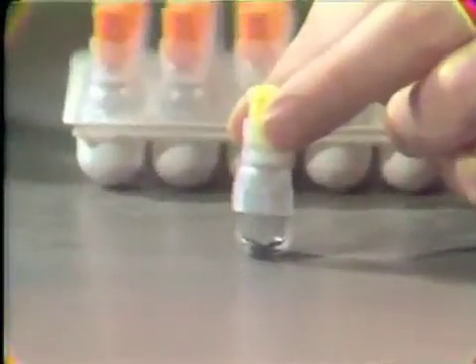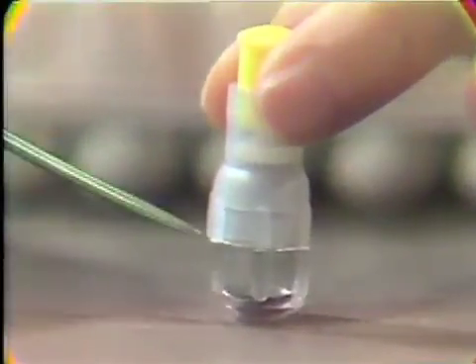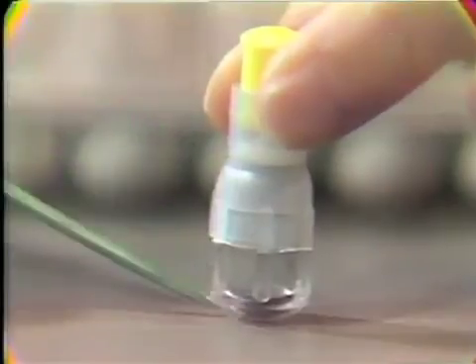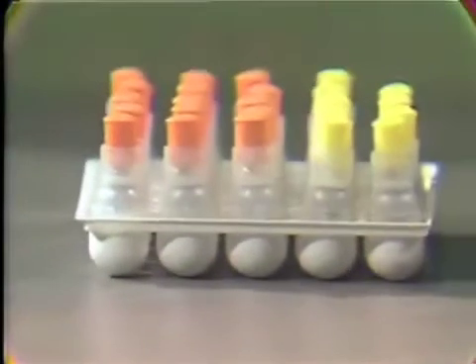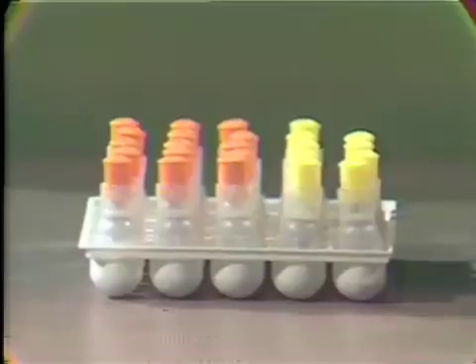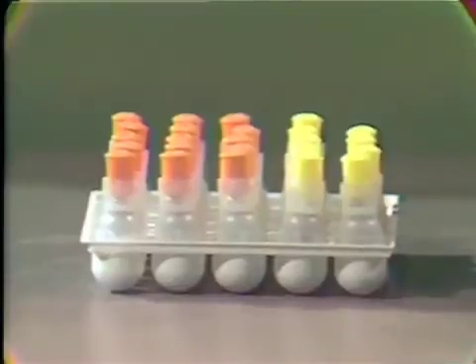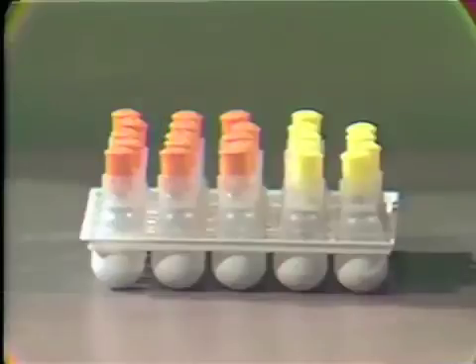The pre-measured capsules are made in a two-chamber design. In the upper chamber is the mercury and the pestle. In the lower chamber is the alloy. Using the pre-measured capsule, note the color of the plungers. This type of coating is used by manufacturers to distinguish between a single and a double spill of amalgam. Yellow indicates a single and orange indicates a double spill.